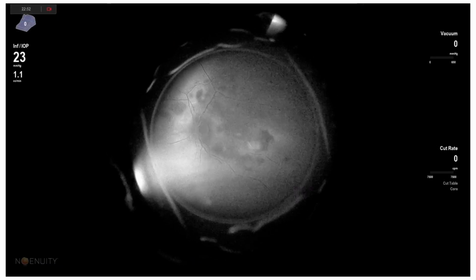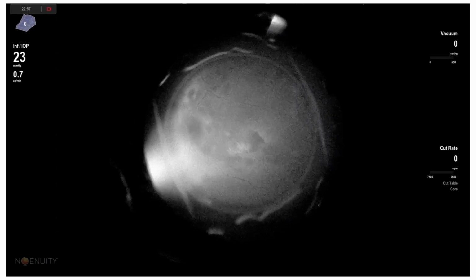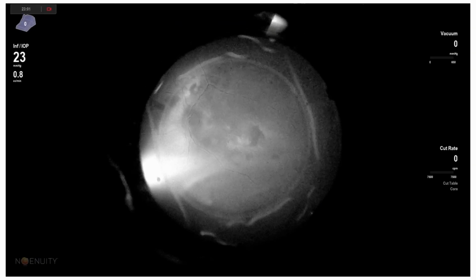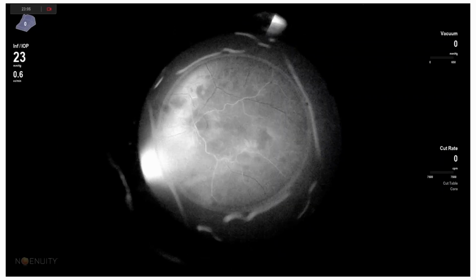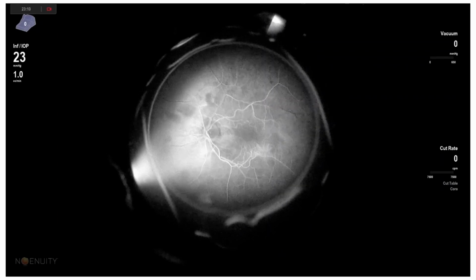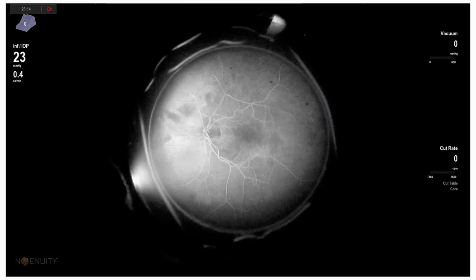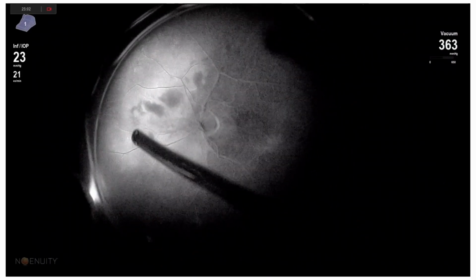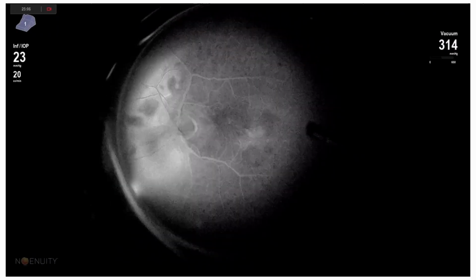And this is another example where, as you can see, the fundus looks more or less normal. It's an epiretinal membrane case. Now this is what we see during the fluorescein angio, and we see a patchy appearance of the RPE, or the choroid, definitely behind the retina, and we see a hyper-reflective structure around the optic nerve. Here is the intraoperative fluorescein angio, but in a moment you will see what we might visualize with the blue reflectance.